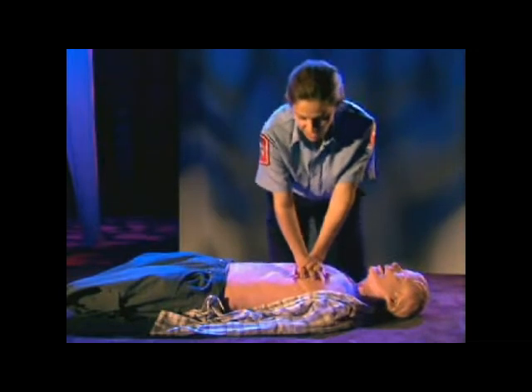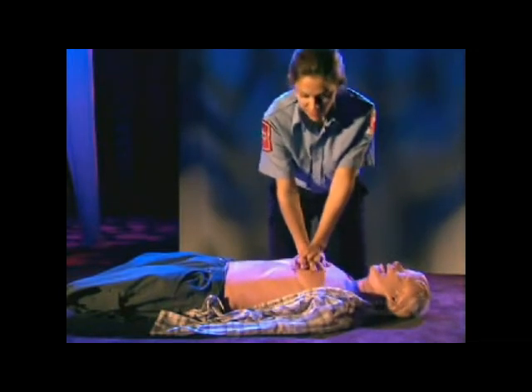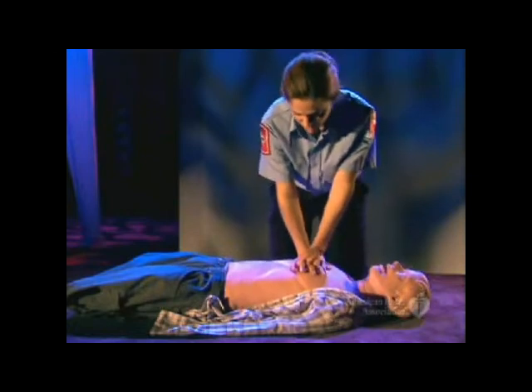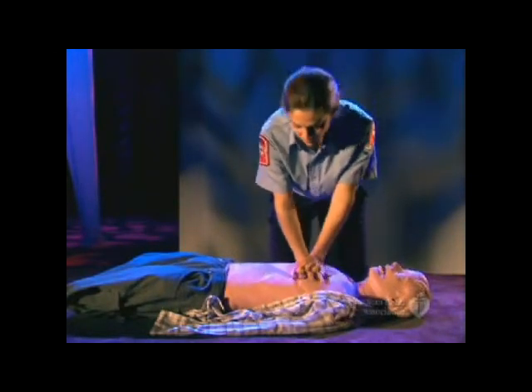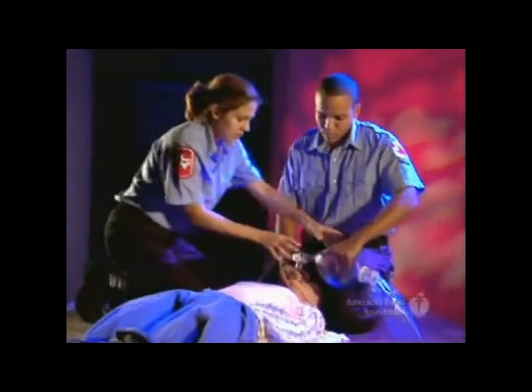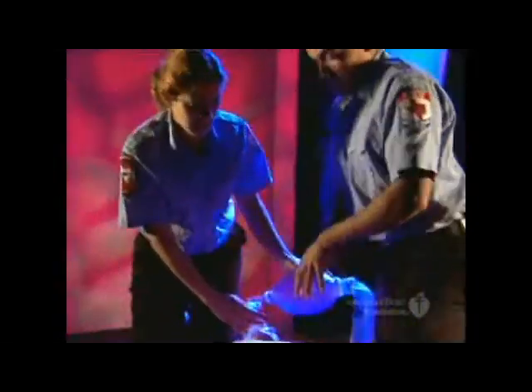When another rescuer is available to assist with CPR at the scene, the second rescuer should activate the emergency response system if he or she is not already doing so, and get an AED. Help is on the way. In 2 Rescuer CPR, each rescuer has specific roles.